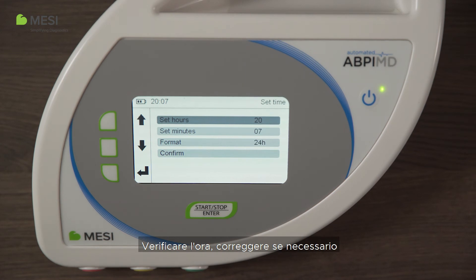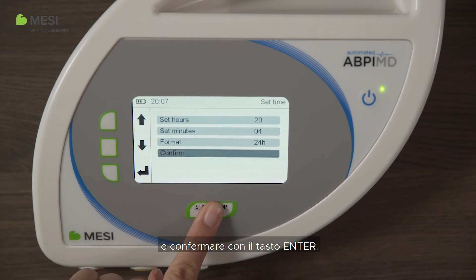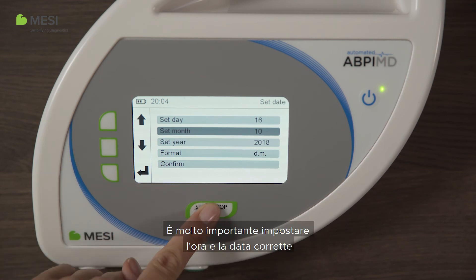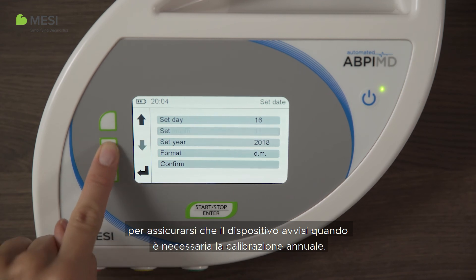Check the time, correct it if necessary, and confirm it with the enter button. Do the same with the date. It is very important to set the correct time and date to ensure the device alerts you when it requires annual calibration.